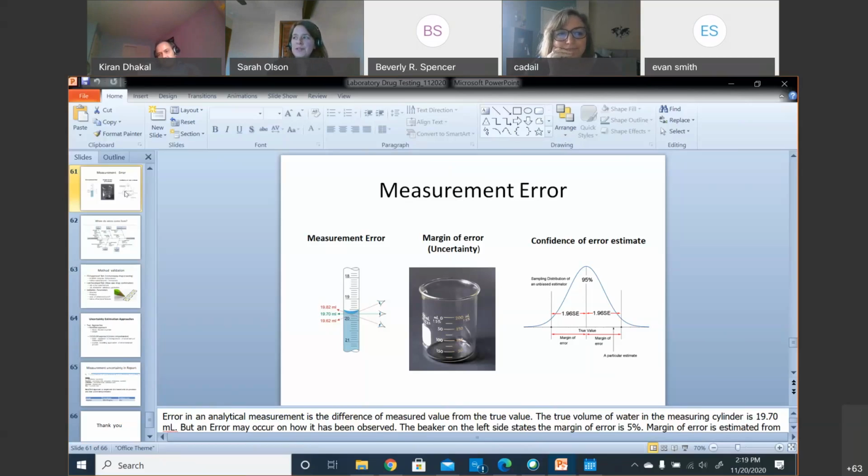I think so, with respect to weight, but what if you're identifying the substance as morphine and you're 95% certain? How would that work? Like 5% of the time it might be something other than morphine? No. It will be morphine. 5% of the time it will be morphine, but your quantitation of 100 nanogram will not be 100 nanogram. It will be 75 nanogram or 130 nanogram. It is no longer within the 20% margin of error. So the uncertainty budget is for the amount, not for the identification of the substance? Yes, correct. Okay.